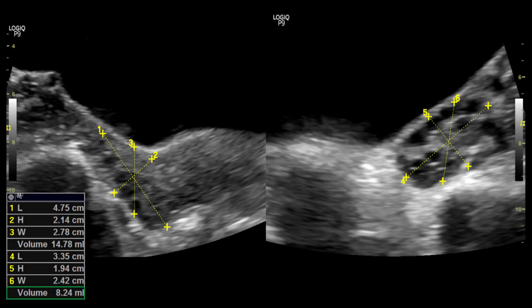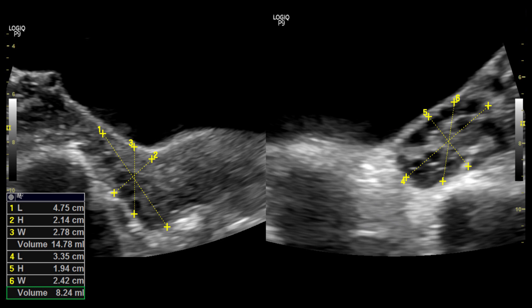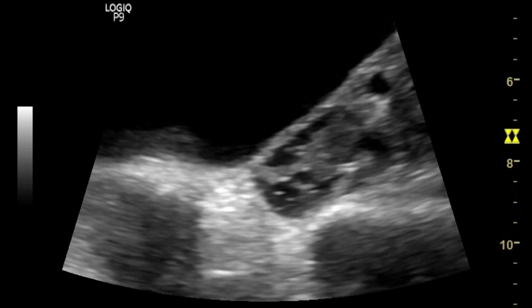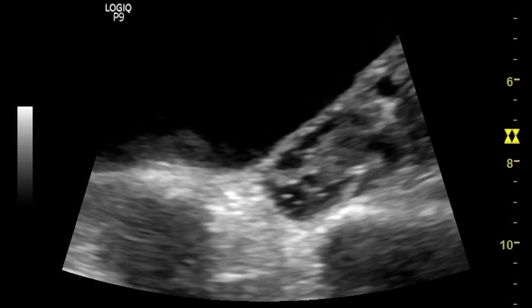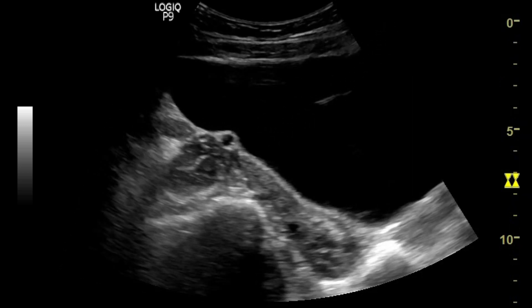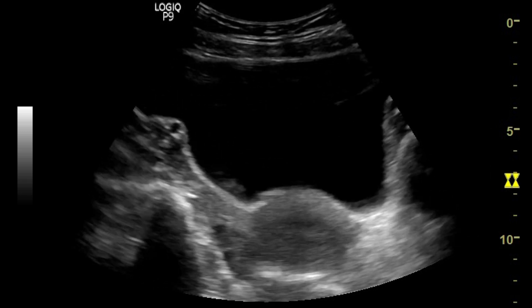Here you can see the transverse section image of the pelvis showing two oval hypoechogenic ovaries. The measurement shows the ovaries are enlarged bilaterally. On real-time, you can see multiple peripherally placed tiny follicles within both ovaries. No dominant follicle is noted.